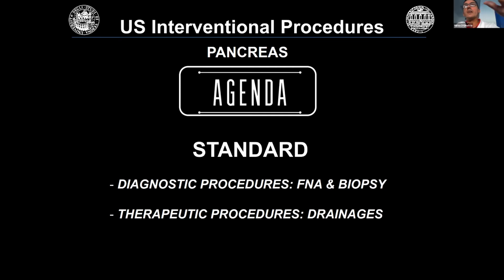For the standard ones, we have diagnostic procedures, for example FNA and biopsy, that can be guided to the pancreas, to a pancreatic mass, obviously by using ultrasound with a percutaneous approach. In this case, we performed an example in one morning.